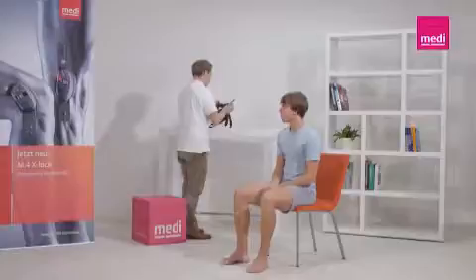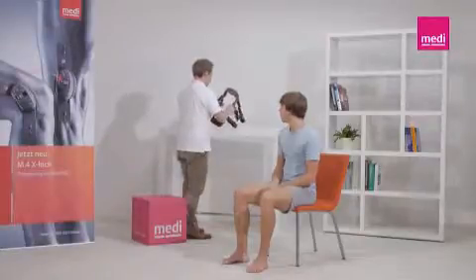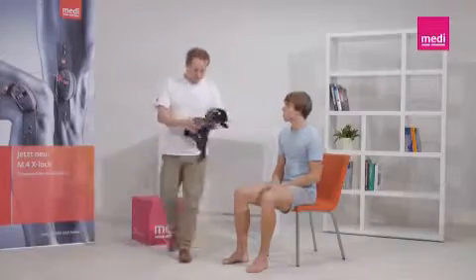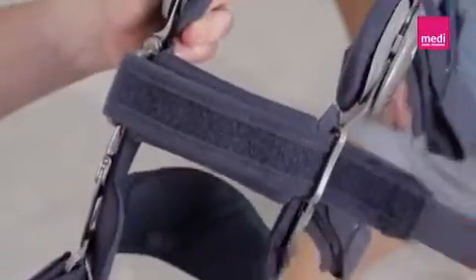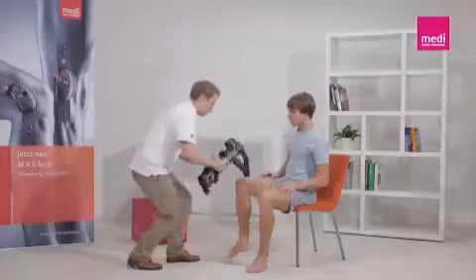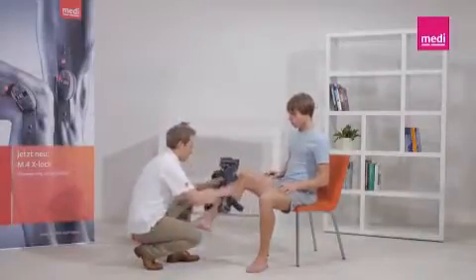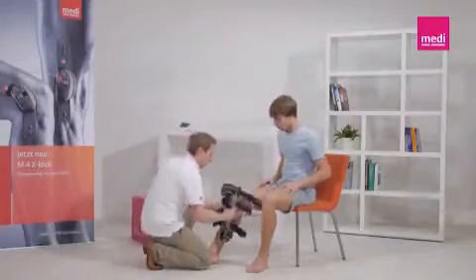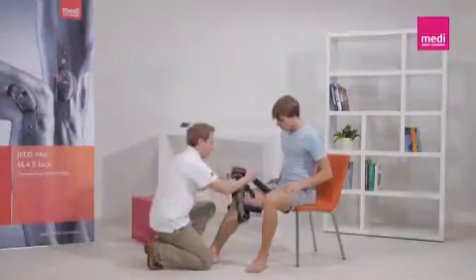The orthosis should be worn directly next to the skin to ensure the best possible fit. Make sure that all the straps are open. To prevent incorrect fastening of the Velcro straps, it is recommended to close them again afterwards. It's best if the patient sits on the edge of a chair. Pull the orthosis over the leg and bend the knee to 45 degrees.